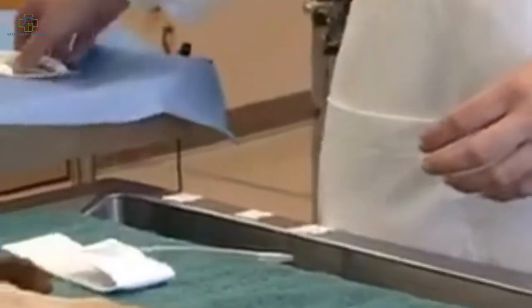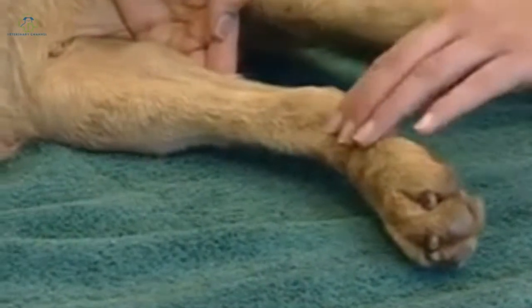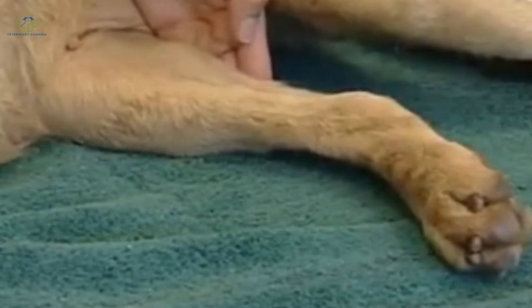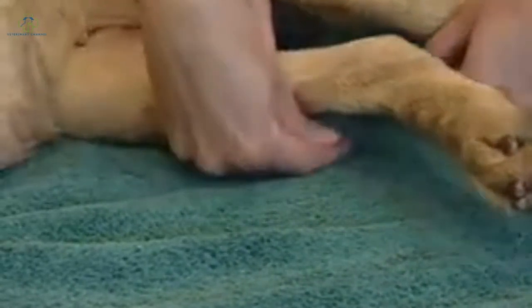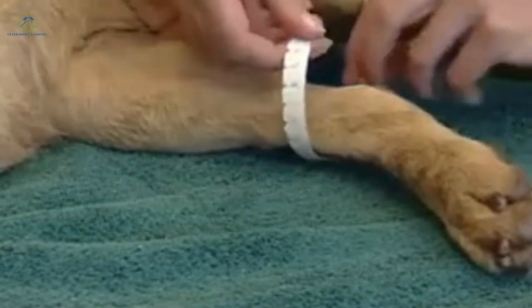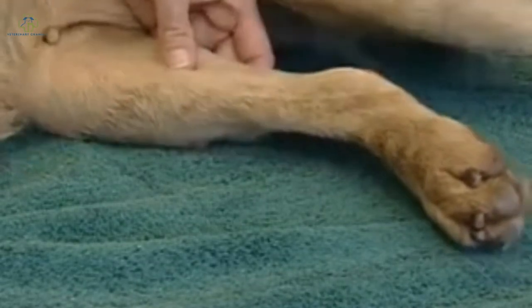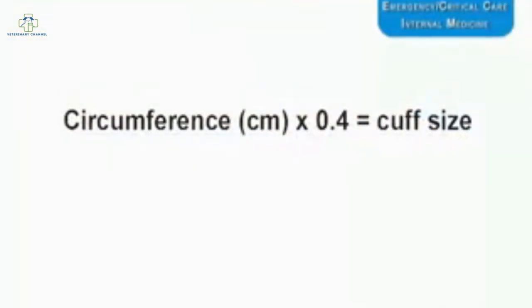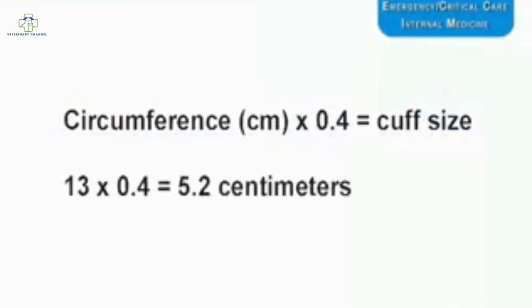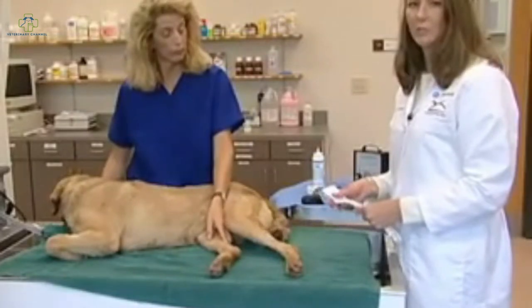One of the first things we do is measure to determine the cuff size. In this case, we're going to use the dorsal pedal artery and measure above the tarsal joint. We measure the circumference of the limb in centimeters — about 13 centimeters in this dog. We multiply this value by 0.4 to determine the cuff size, which comes out at 5.2 centimeters, so we're selecting a 5 centimeter cuff. If the measurement comes out in between sizes, it's best to err on the side of the larger cuff to minimize error.